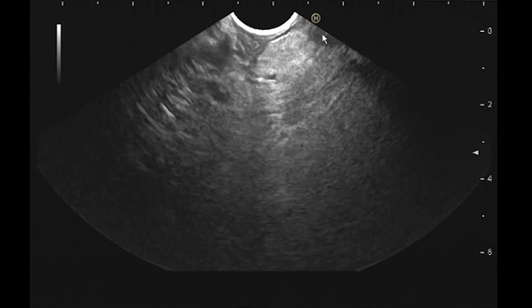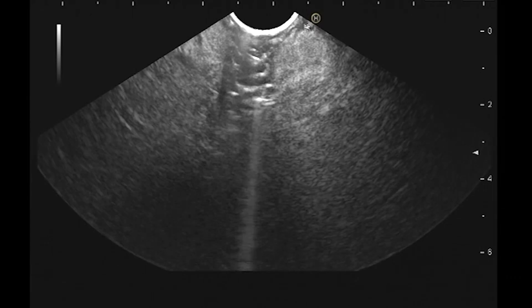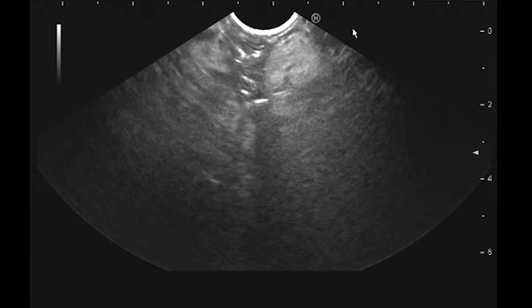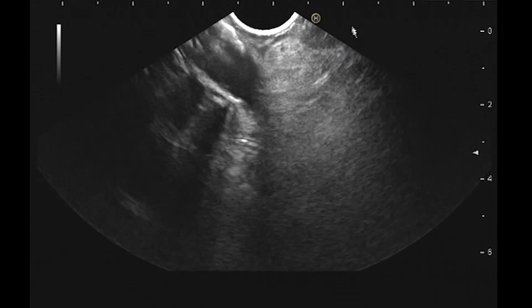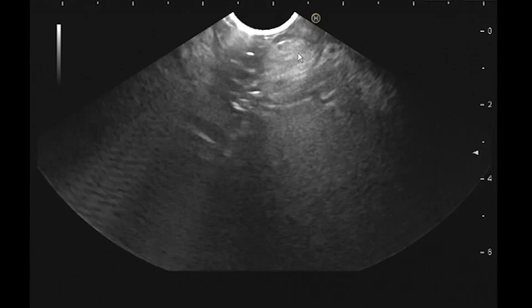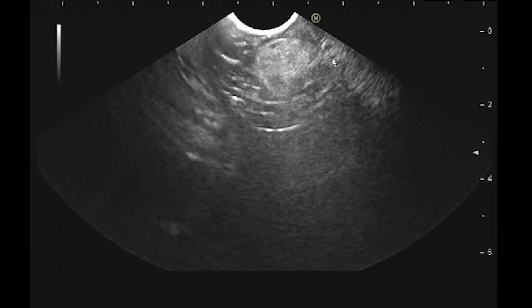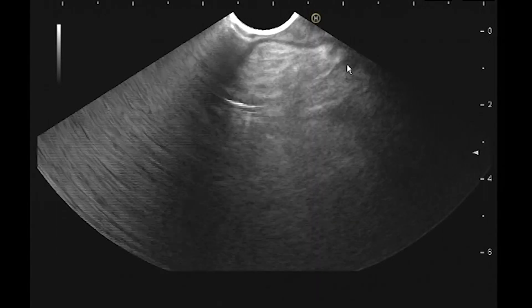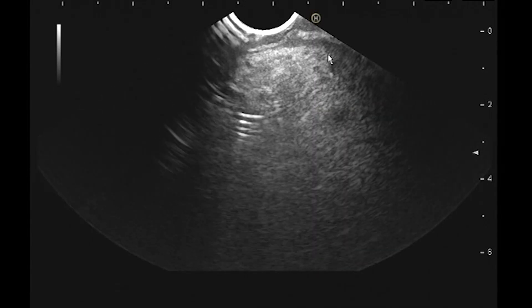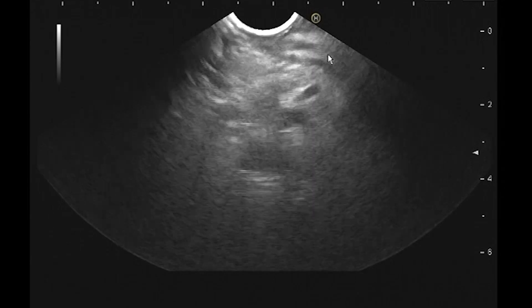As I come back, the papilla is just going to be here. You can see the air in D3. I pull up against the wall and start looking for where it gets dark — that's probably where the papilla is going to be. Doing a bit left and right, looking for the ducts coming out of the papilla. I saw a little line there — that's the PD coming out. There's the PD, and then there's the bile duct next to it. So this is the head and it looks fine.